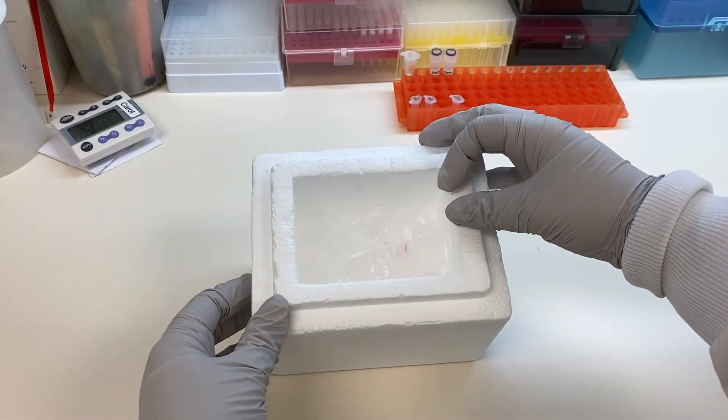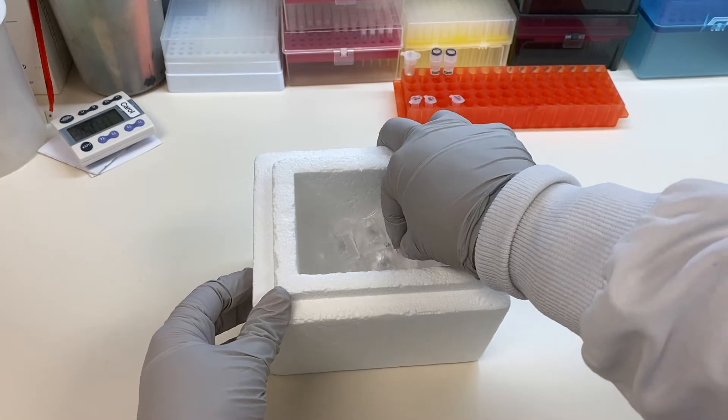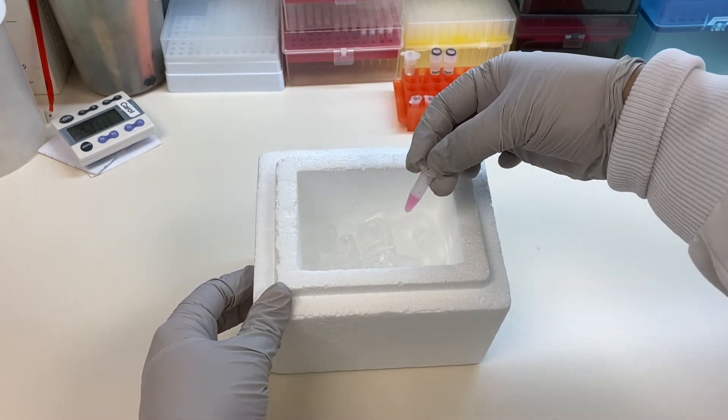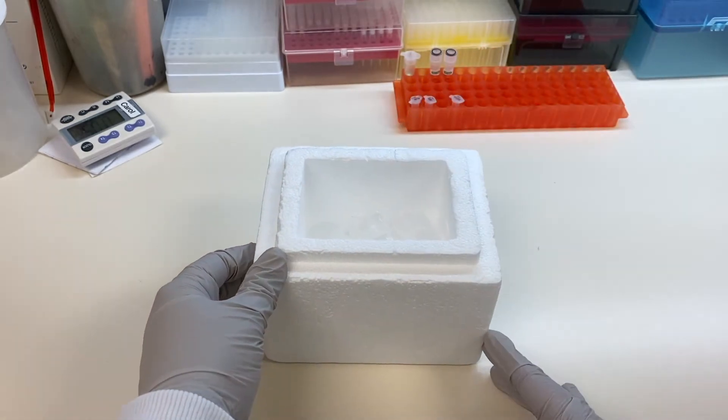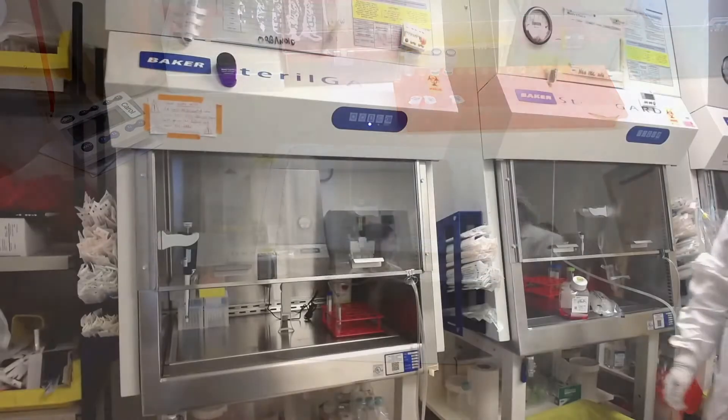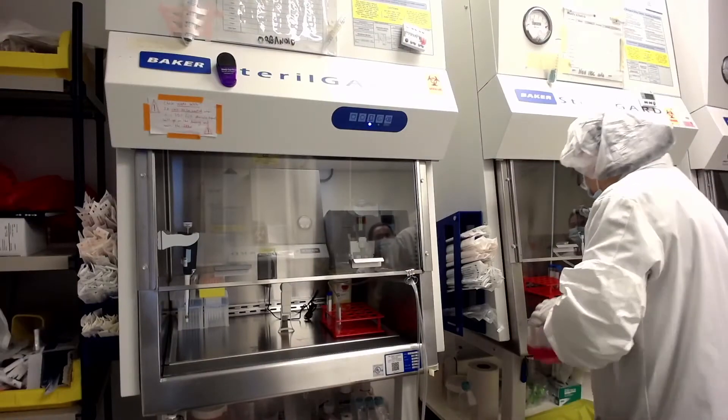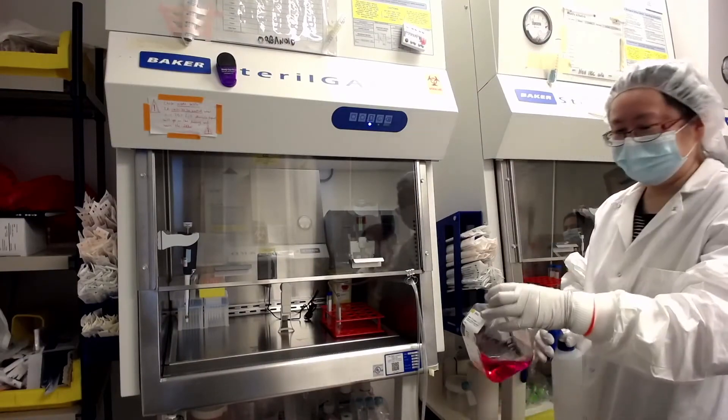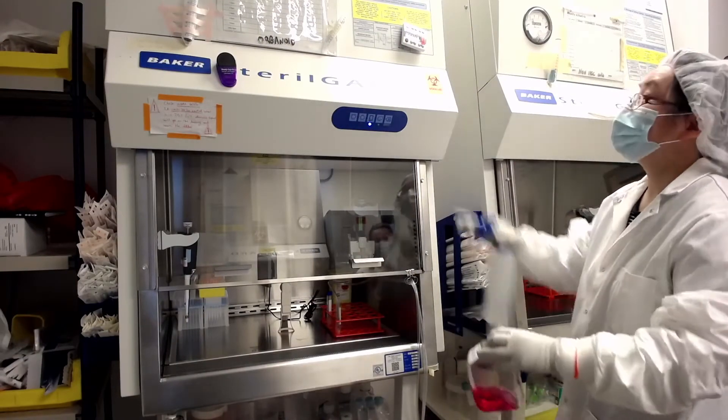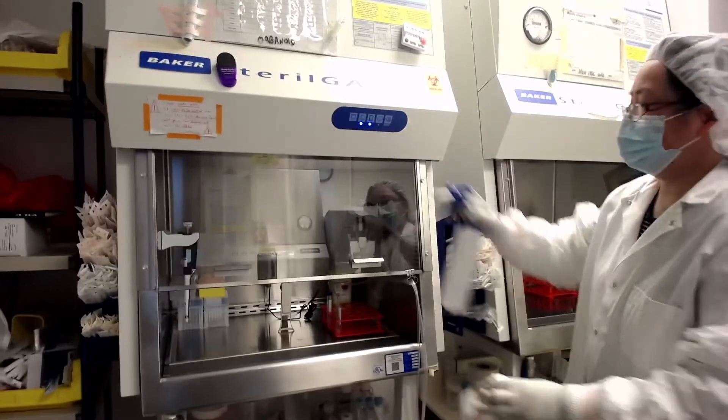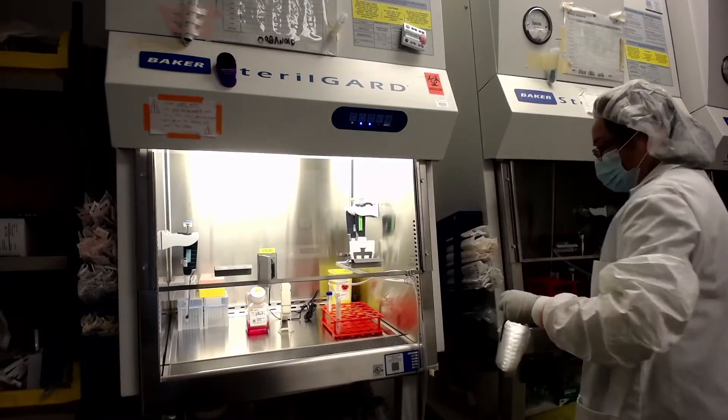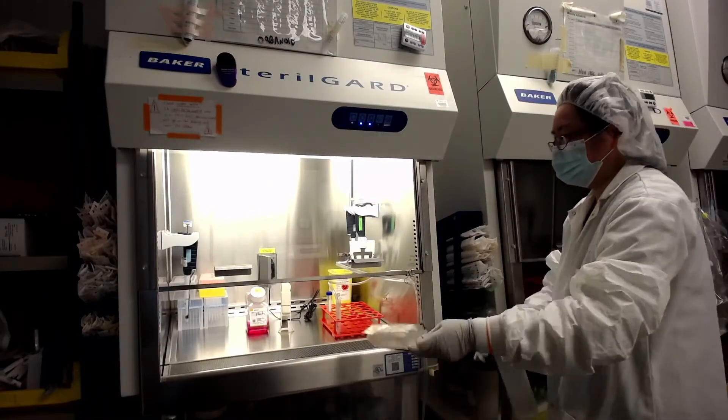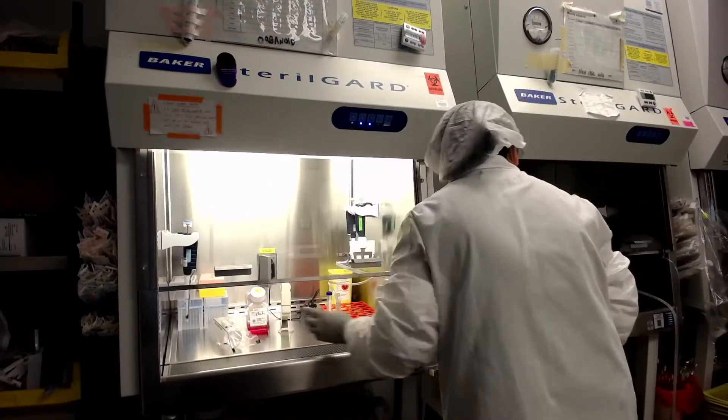Place the icebox inside the BSC. Here is the matrigel aliquot. Transfer cold DMEM with antibiotic and antimycotic and the appropriate sterile culture dishes to the biosafety cabinet. Make sure to spray everything with 70% ethanol to maintain sterile conditions.